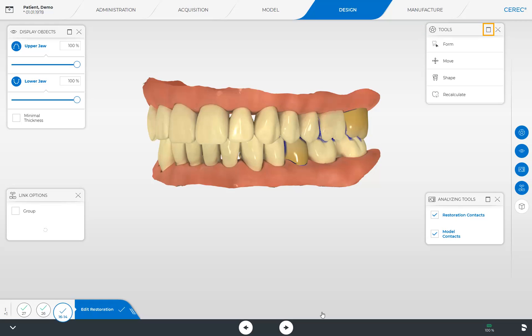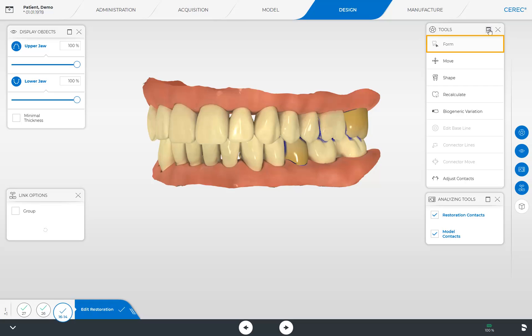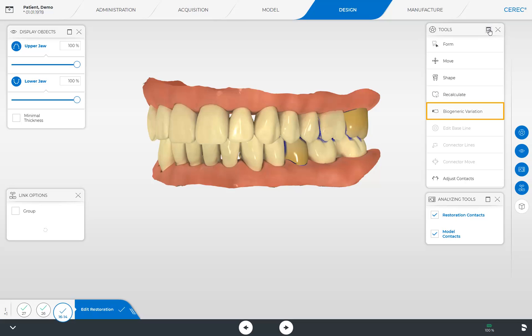We will expand the tools window to full view. Now all tools that are available for the active restoration are displayed. The Form tool allows you to add, smooth, and remove material. The Move function allows you to position, rotate, and scale the restoration. Using the Shape tool, parts of the morphology can be preselected and modified either anatomically or circularly. Below this, the option to recalculate the active restoration is located. Biogeneric Variation allows you to create different morphologies. Finally, there is the Adjust Contacts tool, which we will look at later in this tutorial.